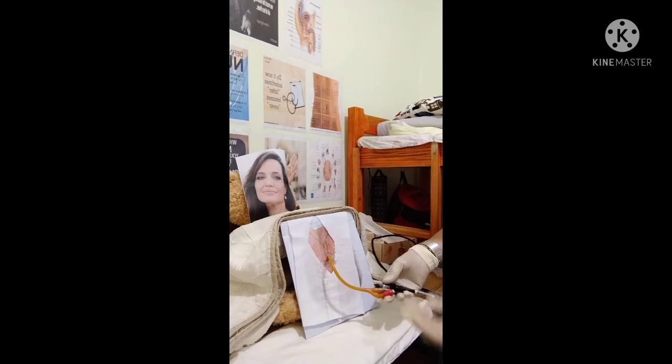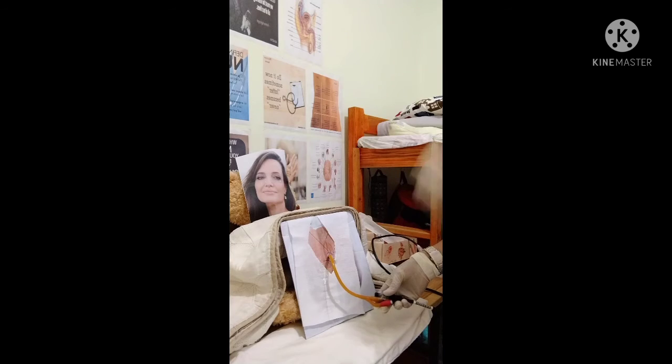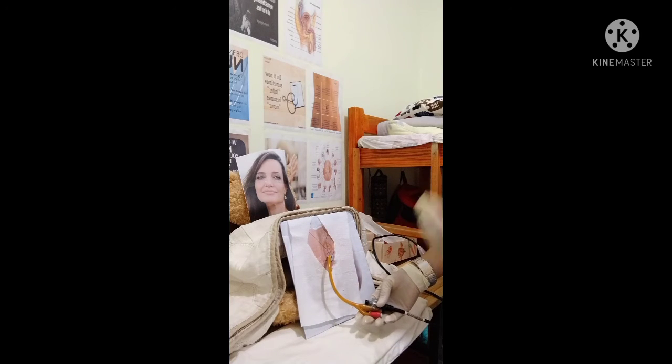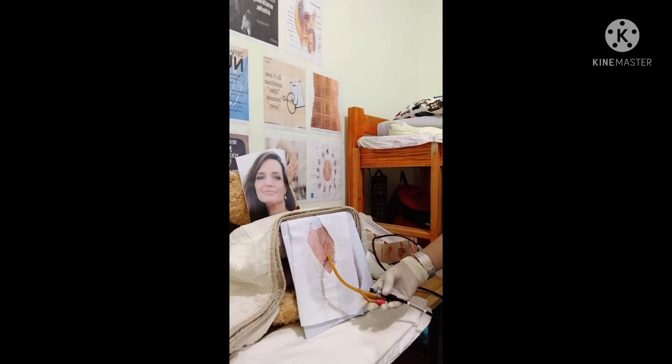So after I inflate the balloon, as I've said earlier, we need to secure the indwelling catheter by taping it to the patient's thigh. So it allows slack of the tubing to accommodate the patient's movement. So this is actually to prevent the catheter from being removed.